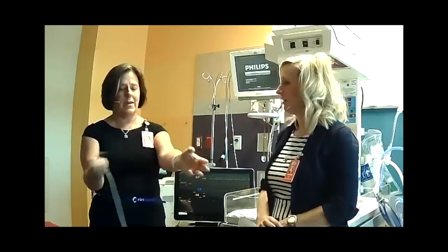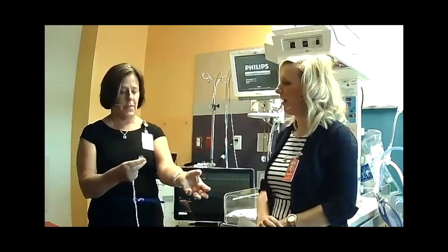Okay, so you addressed it a little bit, but families are wanting to know how they can feel more confident holding their baby who's attached to so many wires. When they're attached to the wires and attached to the ventilator, a couple of things. You've got to understand, some of the wires, it's okay if it pulls off. Like this one on my hand, pulls off, not a big deal, put a new one on. Does that make sense? The little EKG wires, if they pull off, we plug them back in.